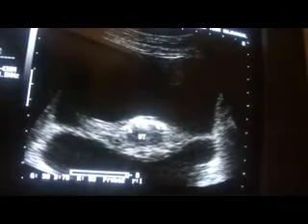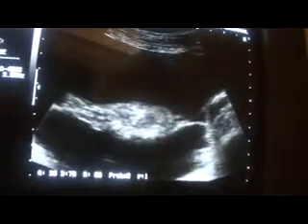So this is how the uterus appears in cross-section and in longitudinal section through ascitic fluid. This is how we see the ovaries as well, in longitudinal section.